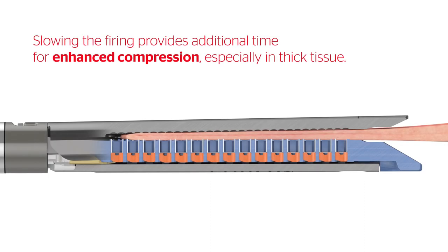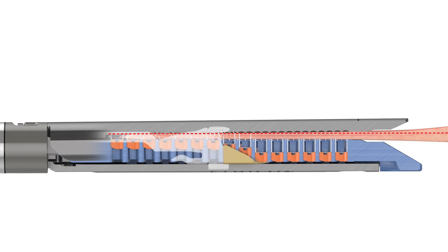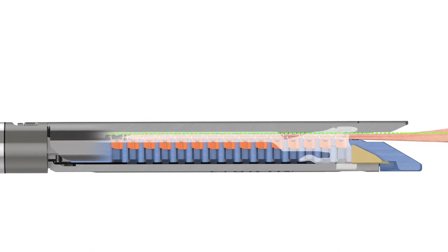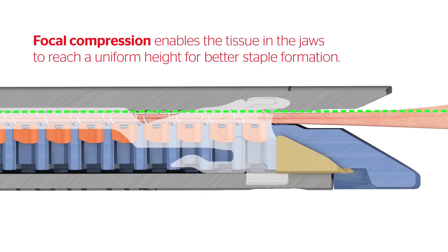Slowing the firing provides additional time for enhanced compression, especially in thick or dense tissue. Focal compression enables the tissue in the jaws to reach a uniform height for better staple formation.